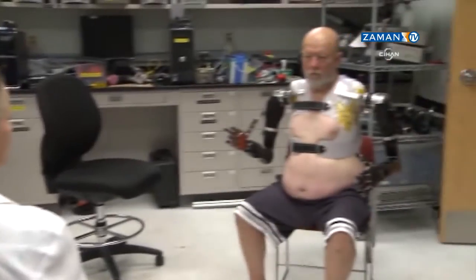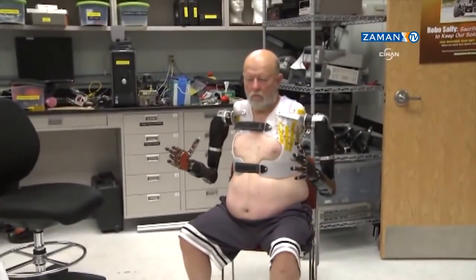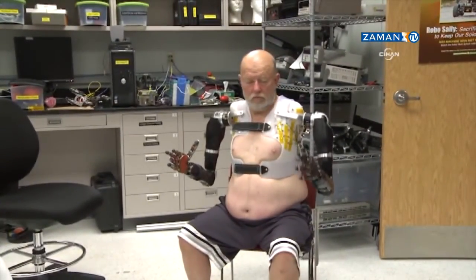Les and the team were about to make history. Once the training sessions were complete and they released me and let me be the computer, to control that arm, I just go into a whole different world.